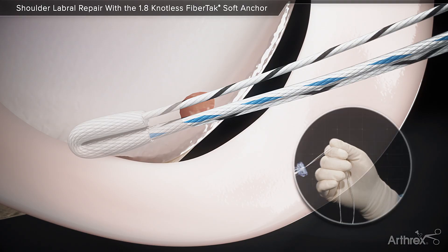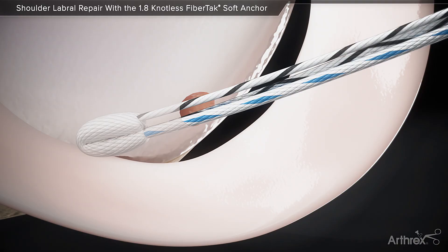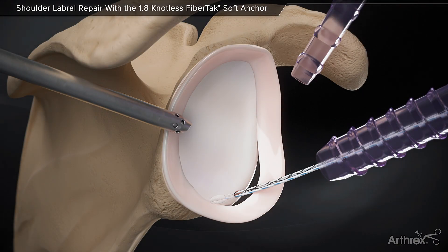Set the anchor by grasping all suture limbs and pull at a slow, consistent pace until the anchor is firmly set in bone.